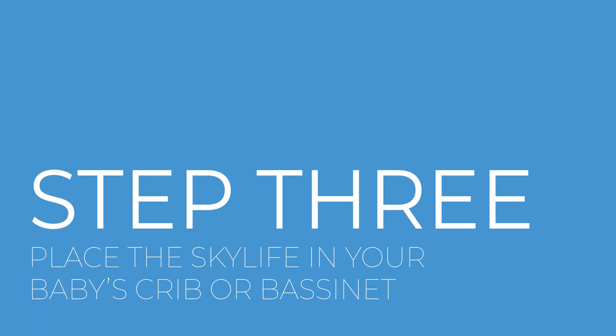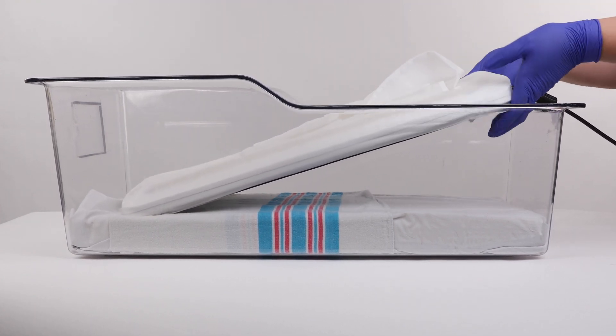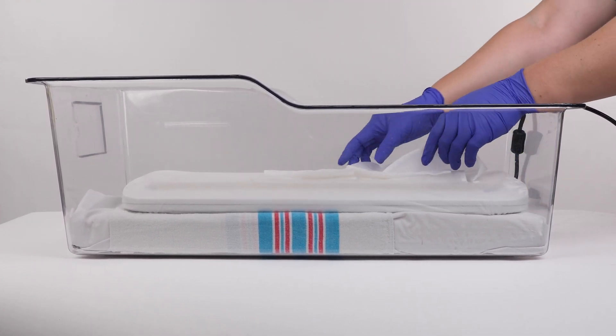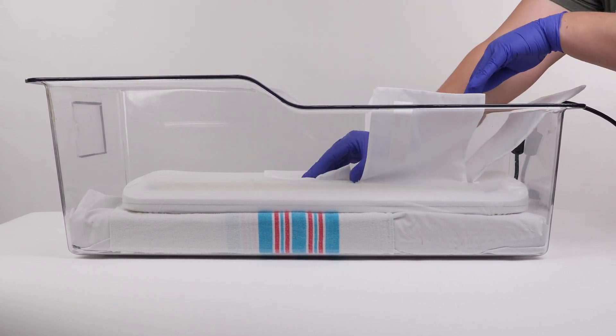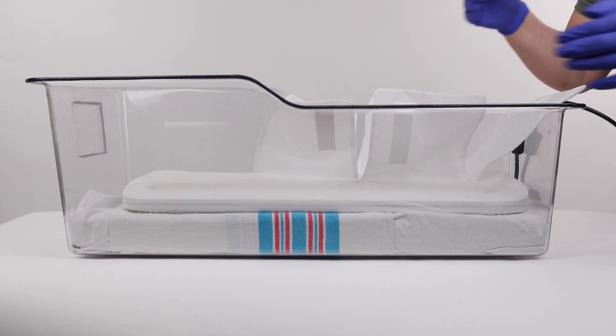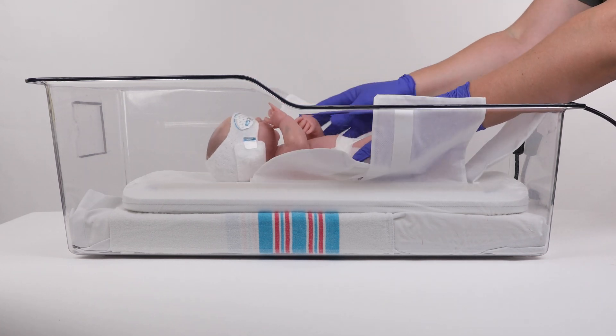Step 3: You are now ready to place the Skylife device in your baby's crib or bassinet. The Skylife device may be used in any sleeping area that is at least 24 inches long and 13 inches wide. The sleeping area should also contain protective walls on all four sides.